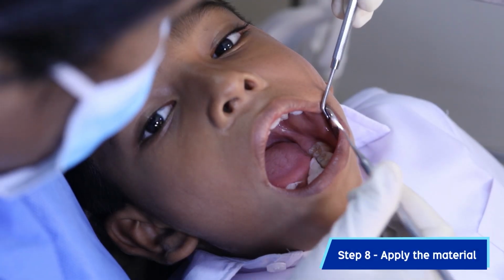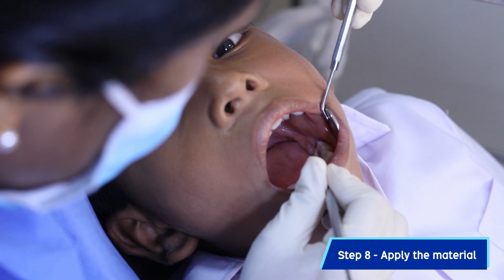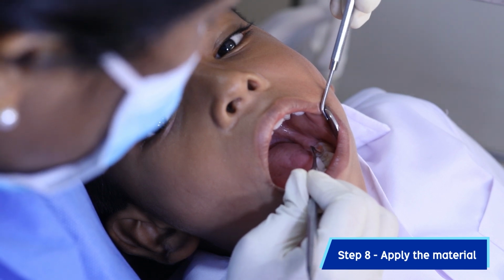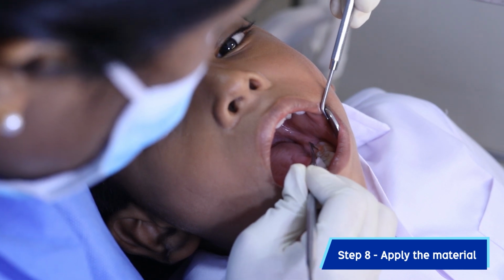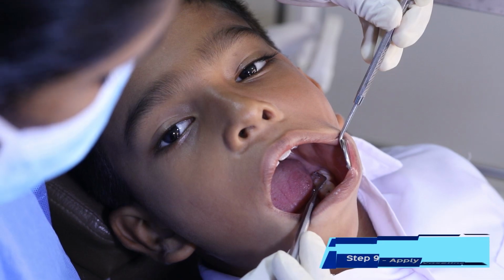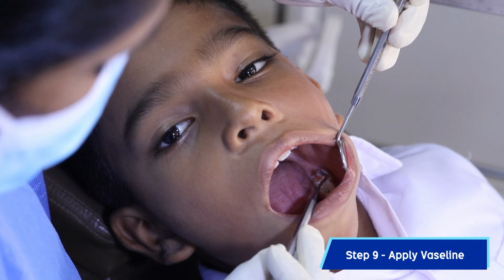Sealant material should be applied using a plastic filling instrument without incorporating air bubbles. The material should be distributed uniformly and smoothly into the fissures and then remove excess material using the plastic filling instrument. Apply Vaseline on the sealant material after removing the excess.